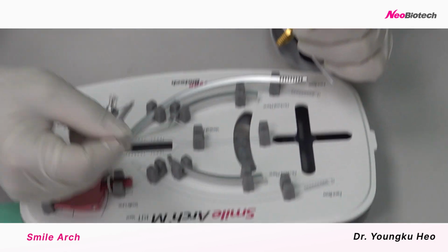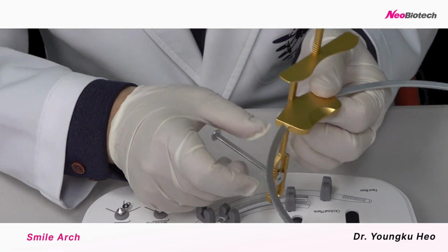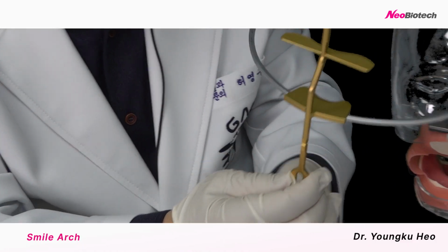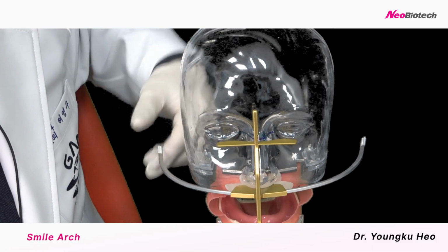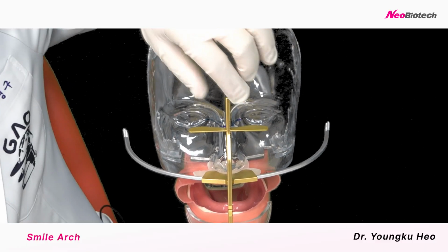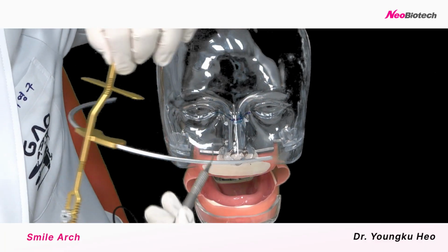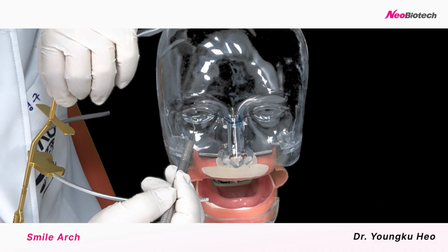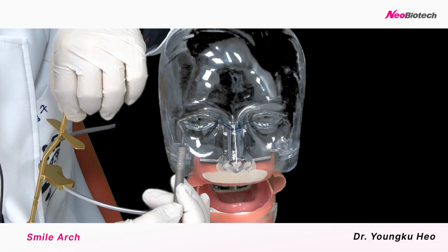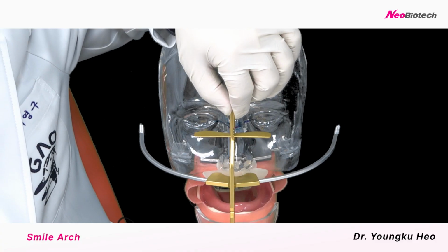And we can put this face bow major point like this. And we can see this line, this is the interpupillary line here. There's a tail of the eyes. This is the line. If we put it here, we can see just the same level. We can see what's the difference from the standard A point to the patient's IP point.